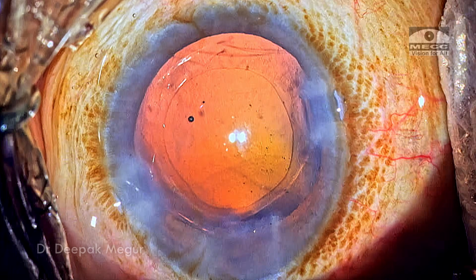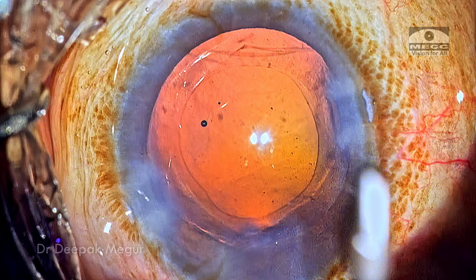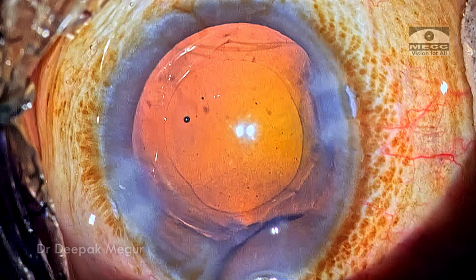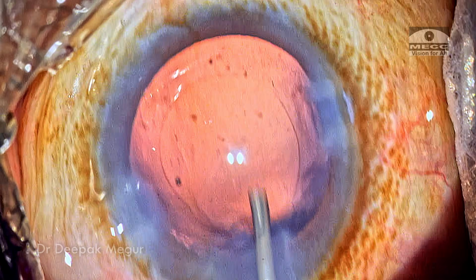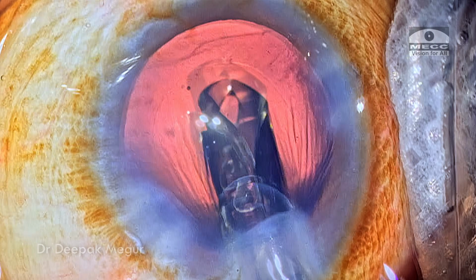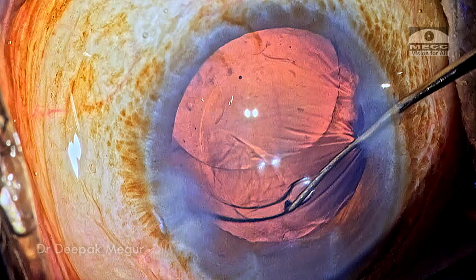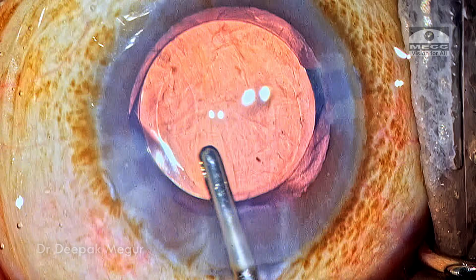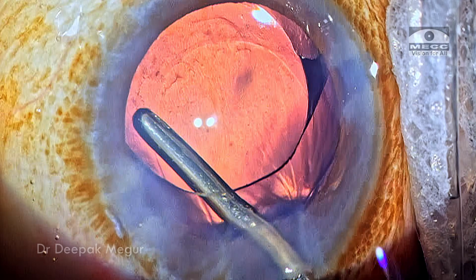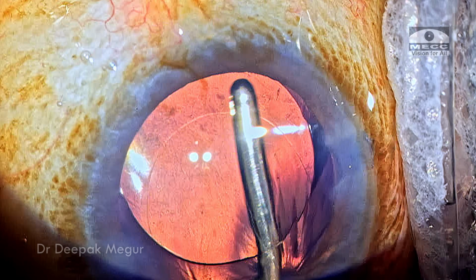This lens which I'm going to inject is a single piece hydrophobic lens, and I decided to go ahead and inject the lens first and see how it sits and whether there is any decentration, and then I'll take a call on CTR. With the bag being inflated with the OVD, the lens is gently manipulated into the bag. It looks alright now. So I'm going to remove OVD both in front and behind the lens and then see whether the lens centers well or not.